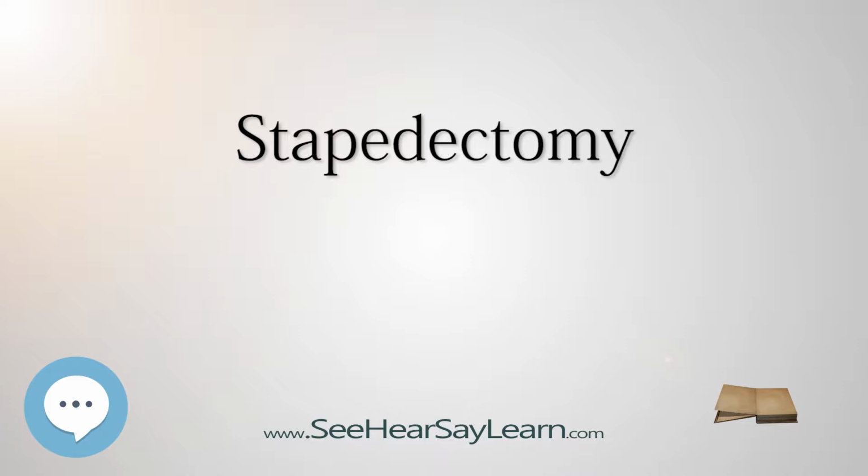In both of these situations, it is possible to improve hearing by removing the stapes bone and replacing it with a microprosthesis, a stapedectomy, or creating a small hole in the fixed stapes footplate and inserting a tiny, piston-like prosthesis, a stapedotomy. The results of this surgery are generally most reliable in patients whose stapes has lost mobility because of otosclerosis. 9 out of 10 patients who undergo the procedure will come out with significantly improved hearing, while less than 1% will experience worsened hearing acuity or deafness.